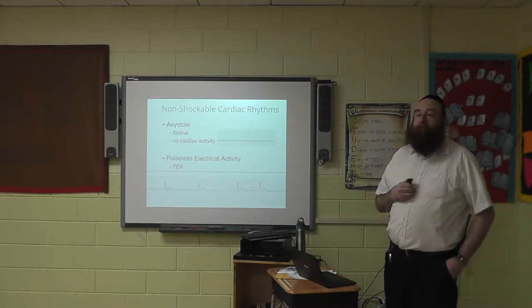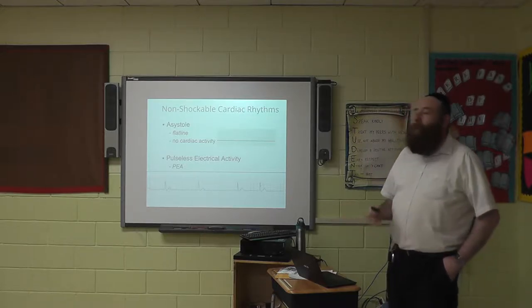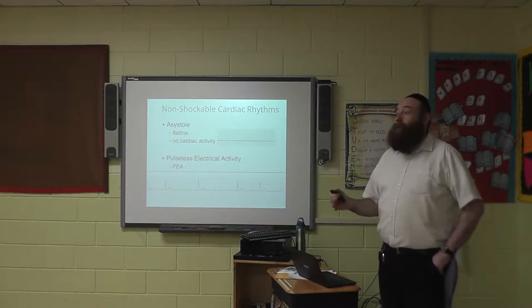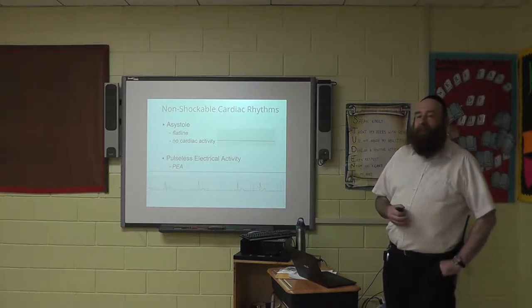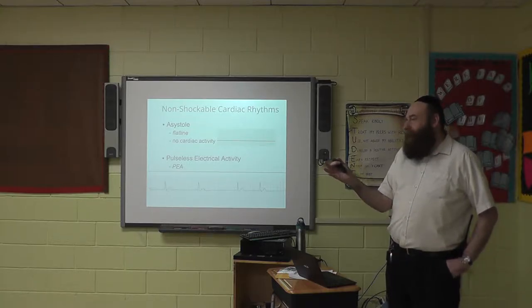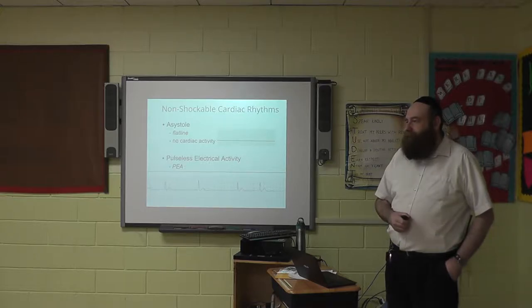Shock. CPR. No. You're doing CPR, the medic sees this. What should he ask you to do? Pause CPR. Safety. Pause CPR, so they can see if this is still the rhythm. Then now what? Check for a pulse.